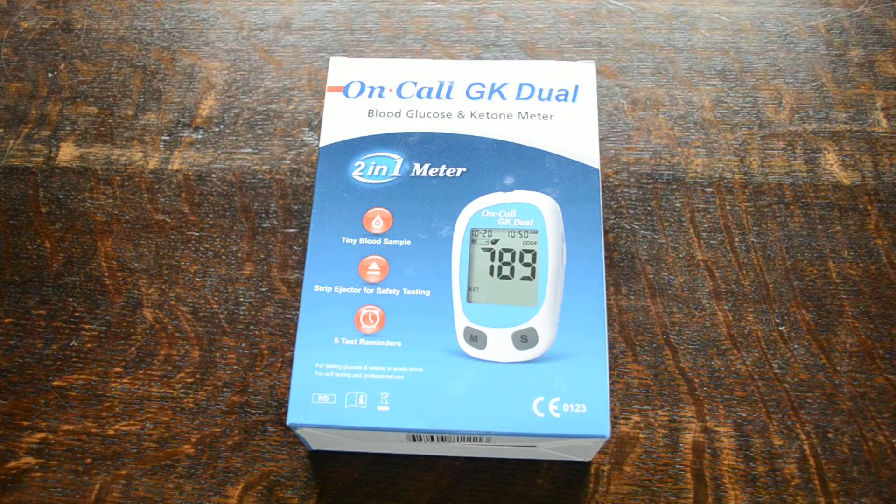So that's the On-Call GK dual plus meter system. It's available from our ValueMed website. We've also created listings on Amazon.co.uk and eBay where packs are available containing the test strips, lancing devices, and auto lancets if you want to purchase those in addition.